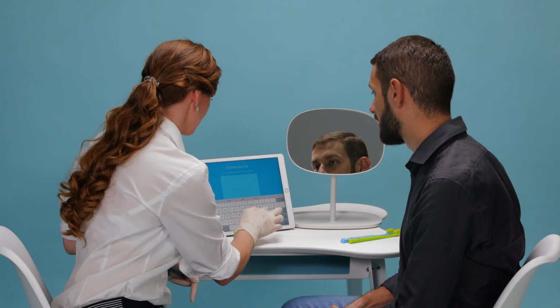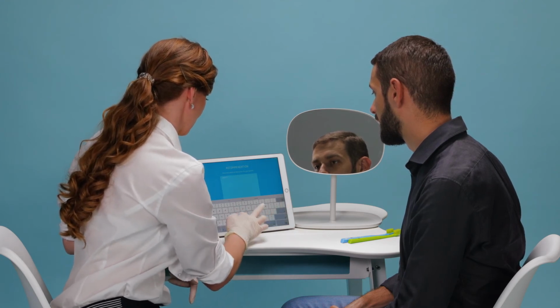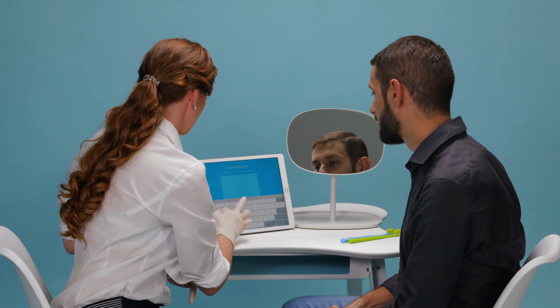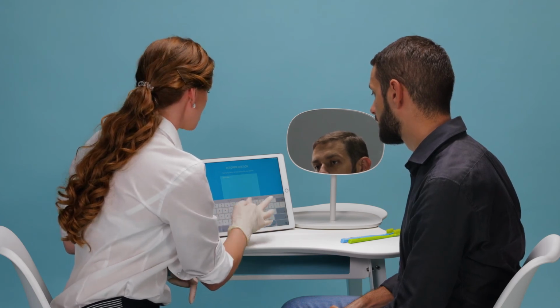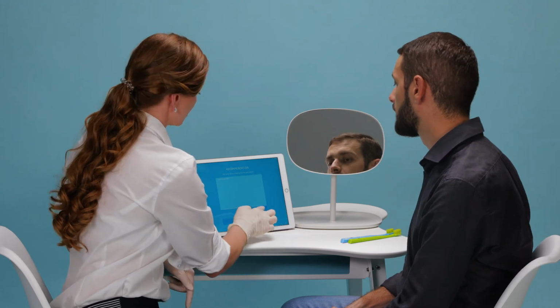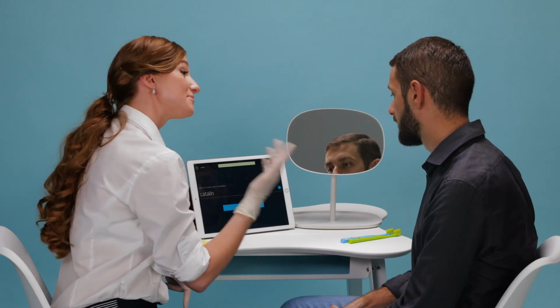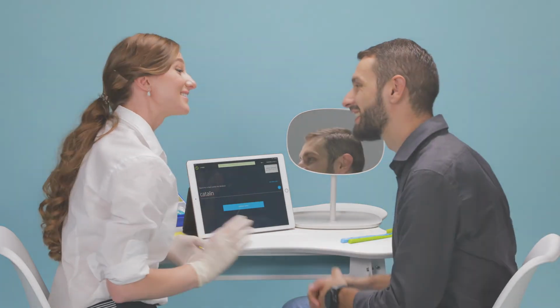The comment I make is that the grey circle on his mouth map indicates the use of the single tufted brush in that region. This is also to remind me on his next appointment what I recommended with the other option. I then save, close this BOP session and send the patient his BOP score, which he will receive via email.